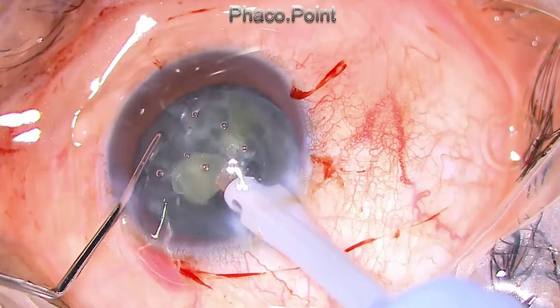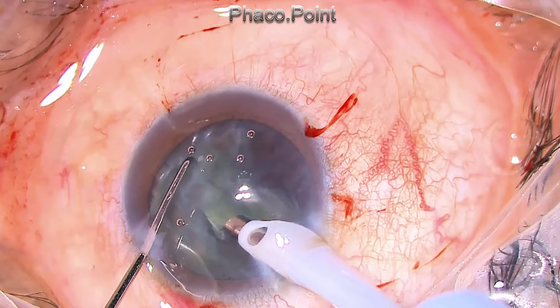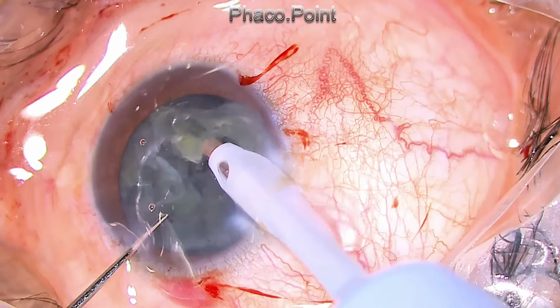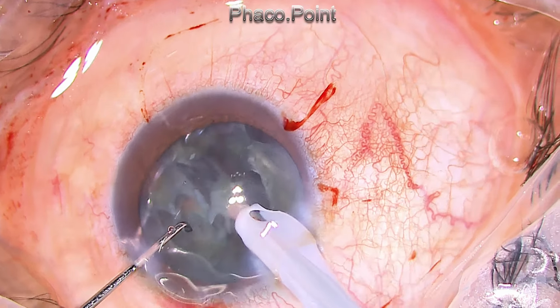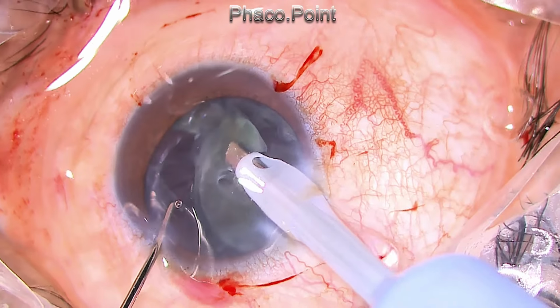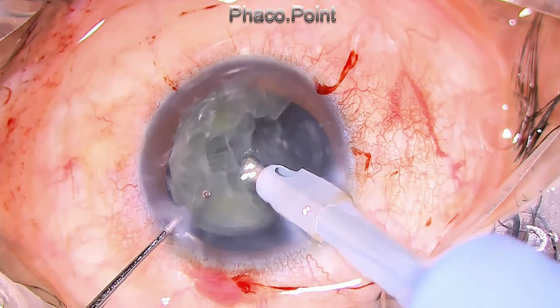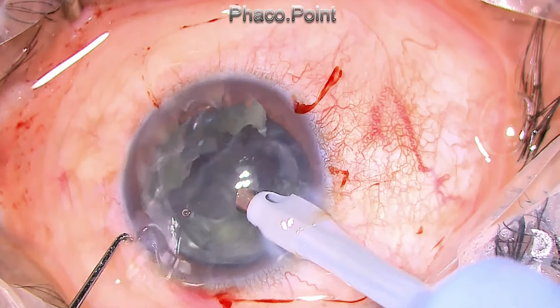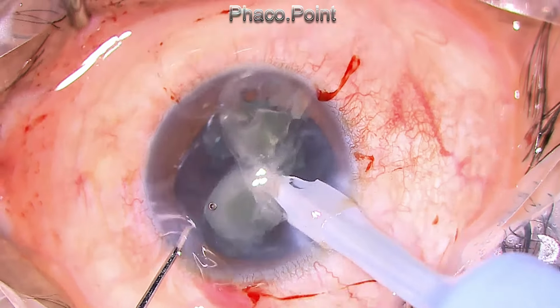I tried to fragment the nucleus, remove the pieces as and when they emerged out of the bag, and then suddenly everything fell into place. Because with the irrigation fluid going into the eye, the nucleus started to become more and more mobile, and little pieces of the nucleus were caught on, aspirated and brought to the center. And then I had a huge slice of luck, because the entire nucleus dislodged itself out of the capsular bag and presented itself in the supracapsular space. And once this happened, the rest of the phaco emulsification was quite easy, and it went on quite smoothly, and I got the entire nucleus out of the capsular bag.